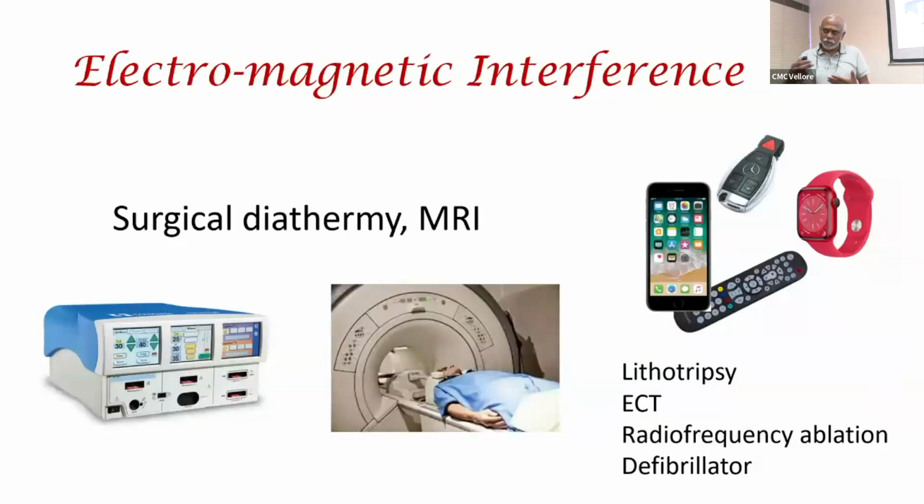As physicians, I don't think you come across it, but we as anesthesiologists are very worried about patients with pacemakers who are coming for surgery, because we work in a very electronically intense area like surgical diathermy. So electromagnetic interference is a big problem, but when we talk about that, we always think about surgical diathermy or an MRI, but there is more to it.